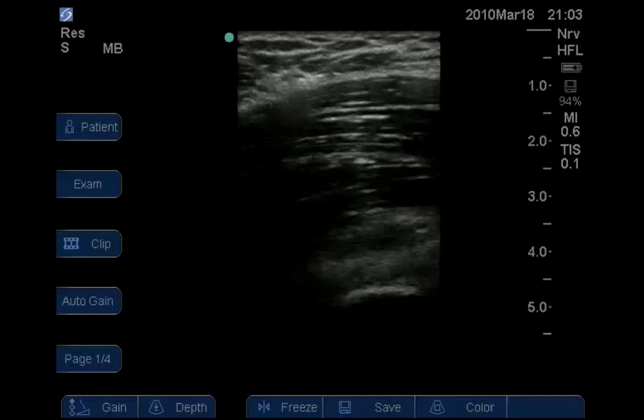Now we know that the muscle that sits directly on the ilium is the iliacus muscle, or iliopsoas muscle. So we want to find the ilium, number one, and then we want to find the muscle that sits on top of that, number two. Now in this area, carefully, in a cephalad direction, there will also be muscle. Now these are the fibres of external oblique. Now it looks slightly different from the iliopsoas because the fibres are running in a different direction.